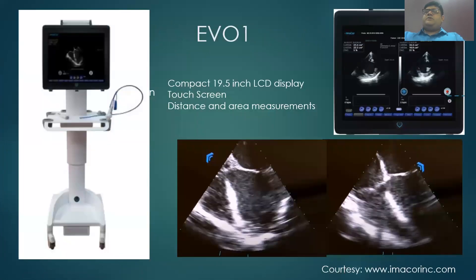The next component of the system is the EV01 monitor. It is compact with an LCD display and touchscreen ability. It offers distance and area measurements and color flow Doppler mapping. There is split screen imaging ability so that one can compare loops, and the sector of the field is around 70 to 90 degrees. The screen can be moved to the right or left electronically with the help of blue arrows.